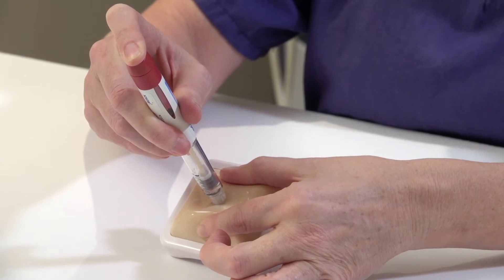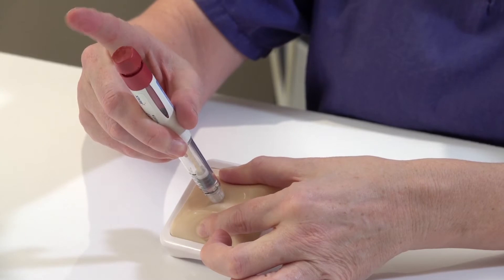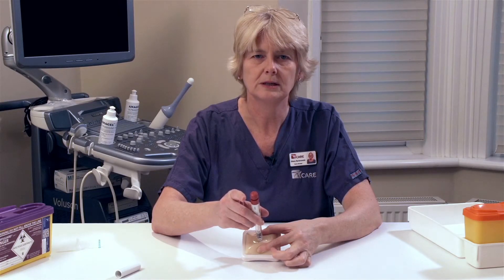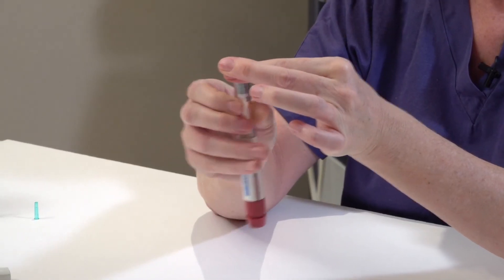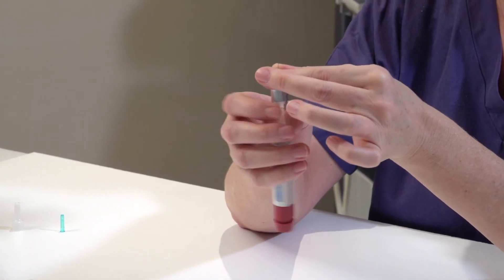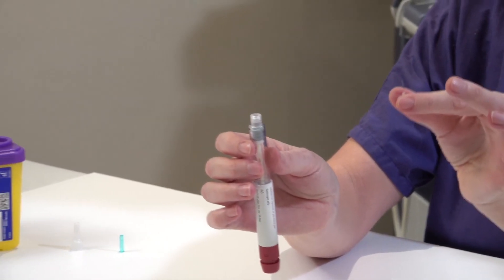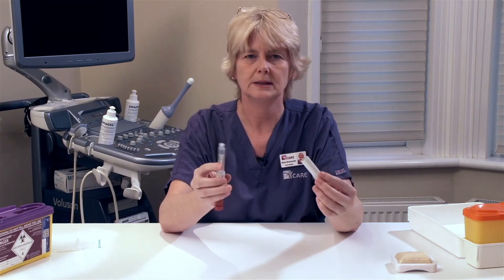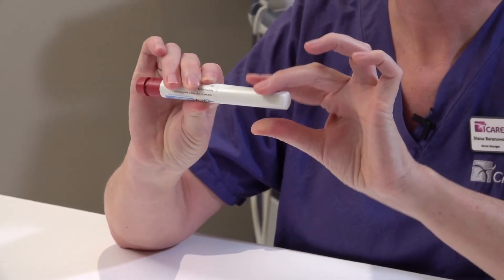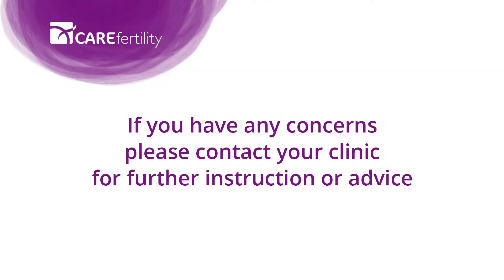Wait for a few seconds. Release your finger from the top of the plunger, then remove the pen from the skin and release your grip. Take a firm grip of the needle and unscrew it from the pen, then discard your needle into your sharps bin. Place the cap back onto your pen and store your pen back in its box for your next injection. Thank you.